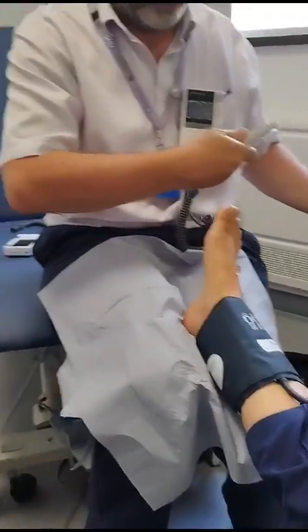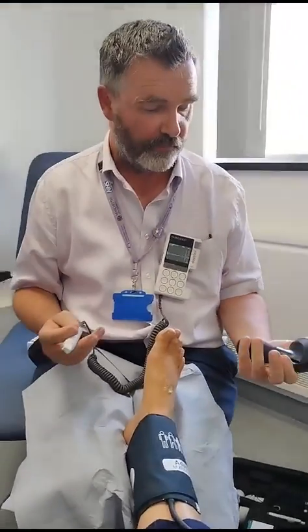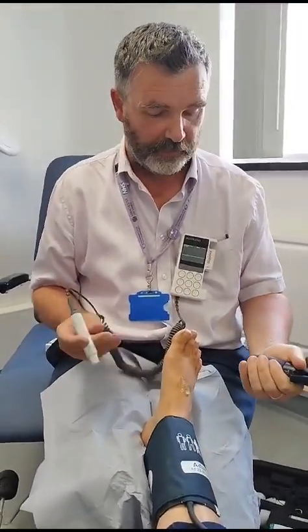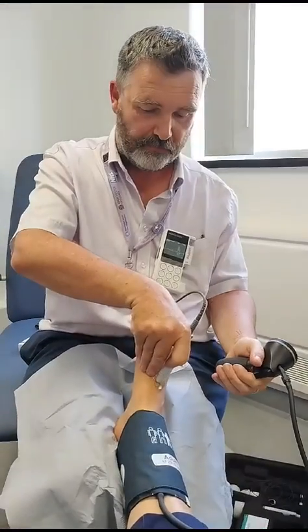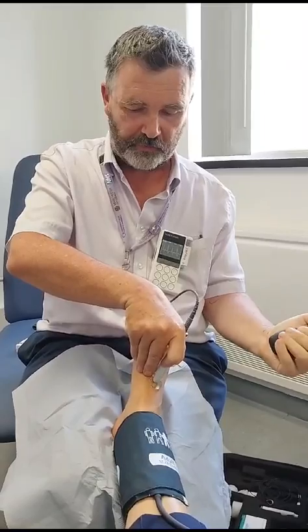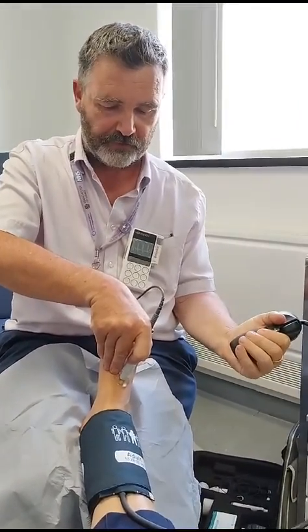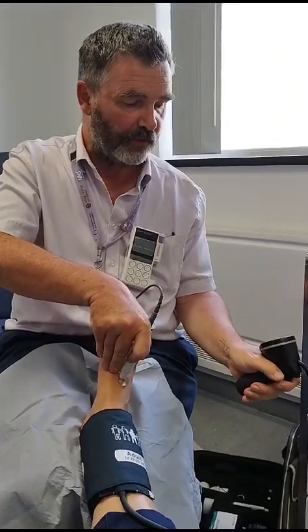I'm now going to use the Doppler and sphygmomanometer together. First, I'll close my trigger, fingers onto the bladder, refine that dorsalis pedis pulse with angle and anchoring. Then inflate — all four fingers through the bladder — listening in between each inflation. Once the sound's gone, one more pump, then deflate slowly.